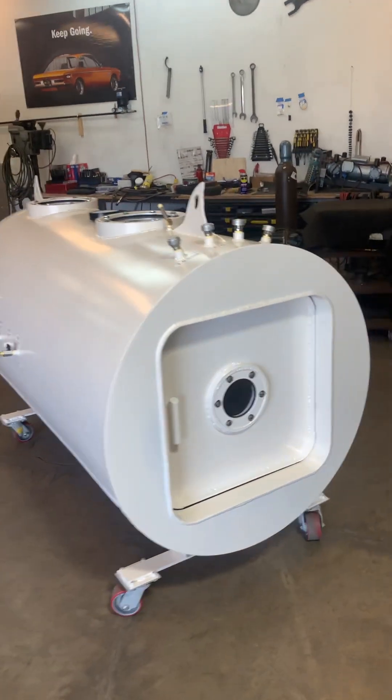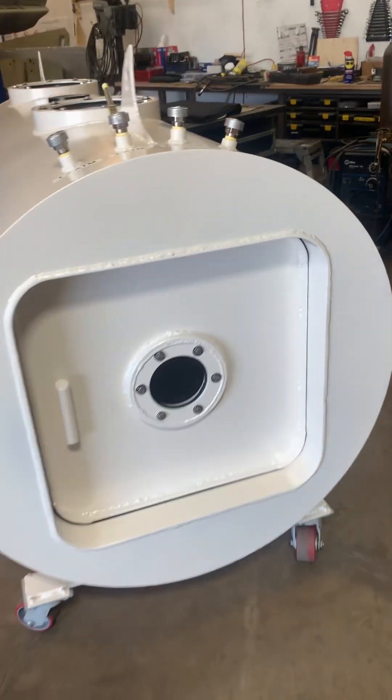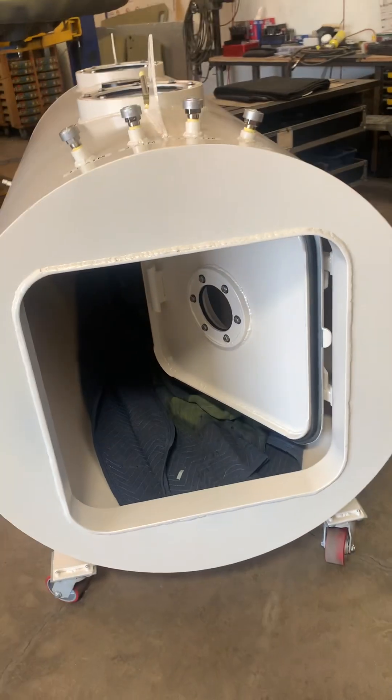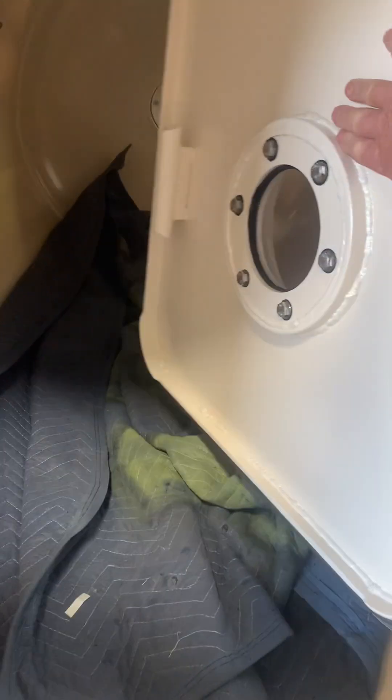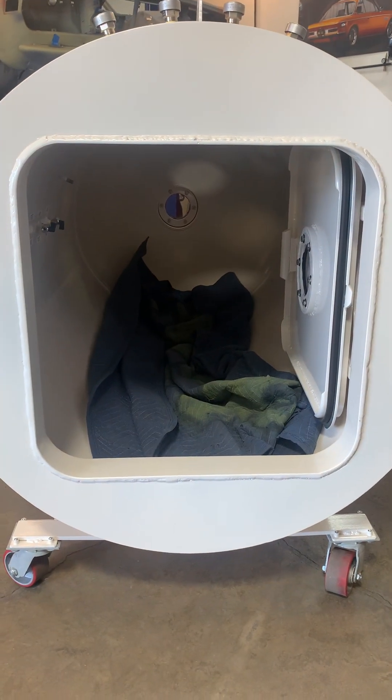We've already put the windows in. As you can see right there, the door works great. It goes back a lot further than that — the square door is able to go back square so you can get in.